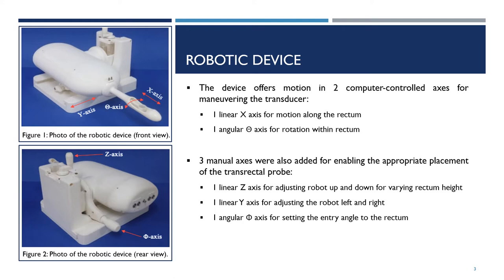Three manual axes were also added for enabling the appropriate placement of the transrectal probe. These include one linear z-axis for adjusting the robot up and down, one linear y-axis for adjusting the robot left and right, and one angular phi-axis for setting the entry angle to the rectum.